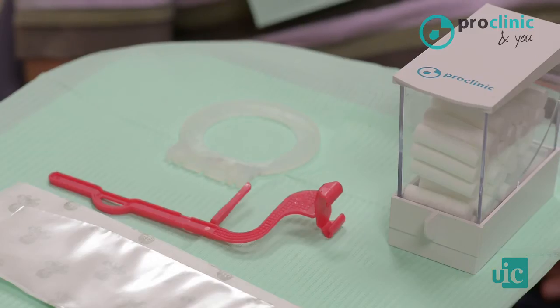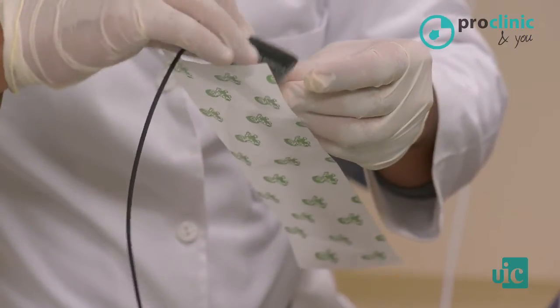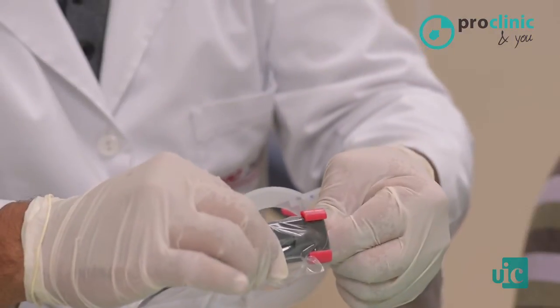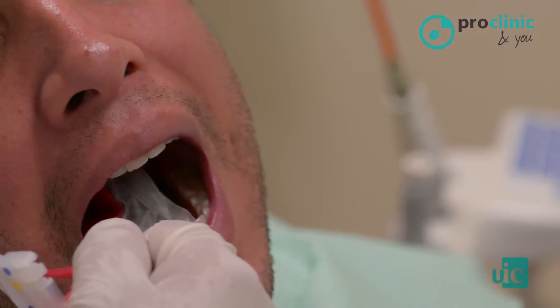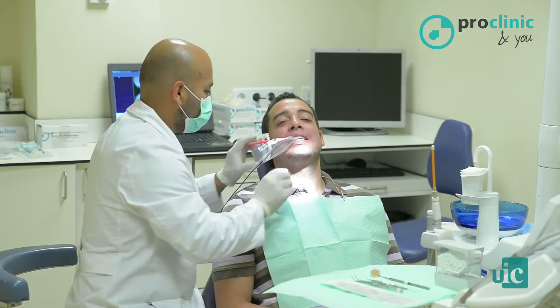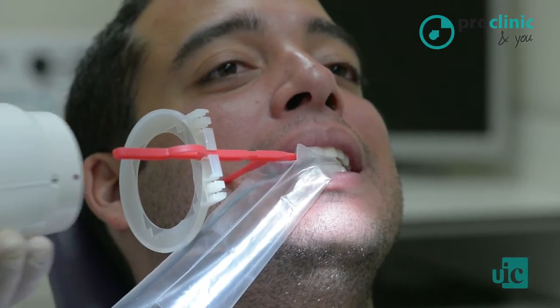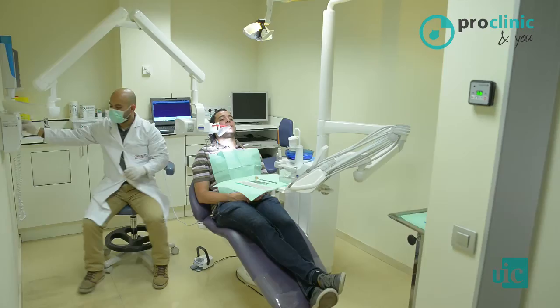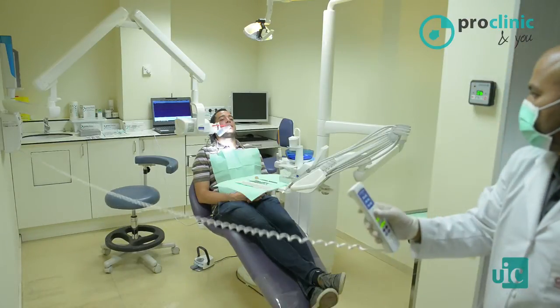The bite-wing radiography allows us to visualize interproximal caries, secondary caries, and the status of the pulp chamber. It allows us to view the status of these cavities in relation to the bone crest. And obviously, if it has any vertical bone or horizontal bone defect. We can also see if there is interdental calculus or tartar, which already gives us a general idea of the periodontal condition of the patient in that area.